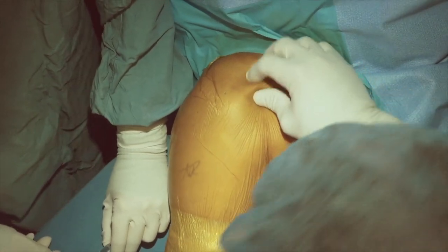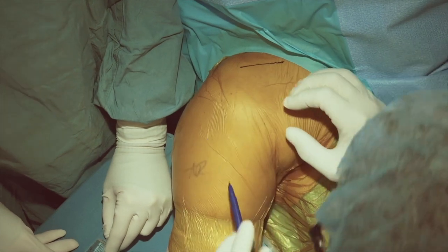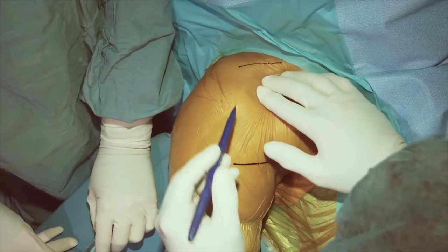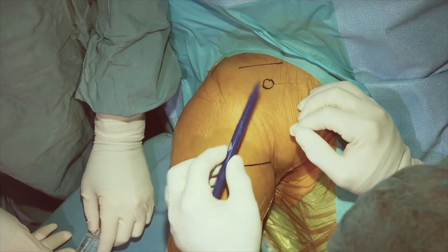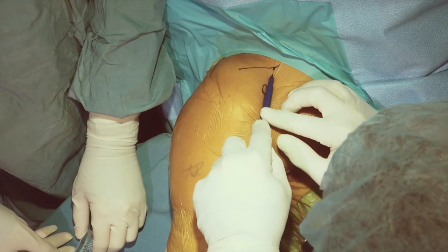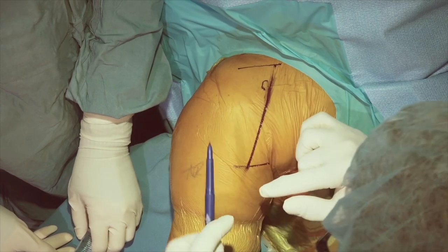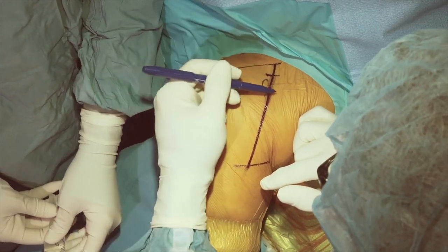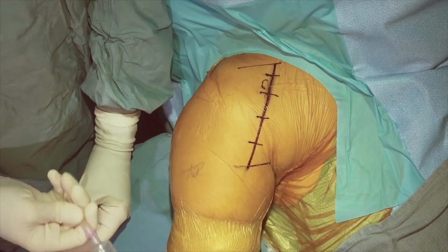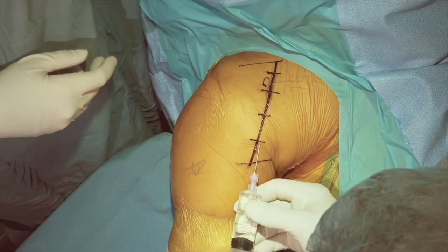We'll get started with this right shoulder arthroplasty and identify our landmarks from the clavicle down to the axilla. We can place a mark and identify the coracoid process. We can often roll our marking pen just off the edge of the coracoid and mark our deltopectoral interval, which will give us our access for the shoulder, whether we're doing an anatomic or reverse shoulder replacement. A surgical timeout has been performed and now we're proceeding with the operation.